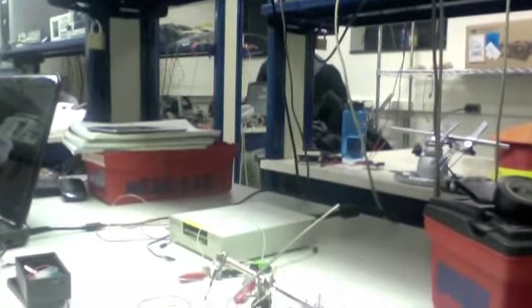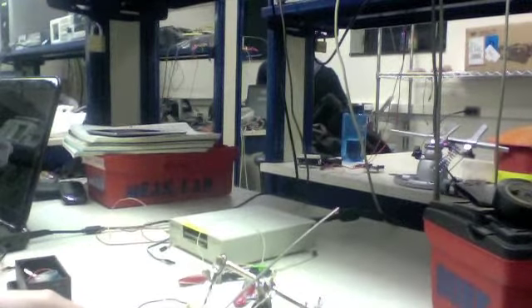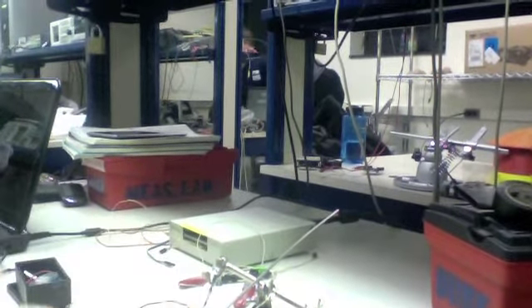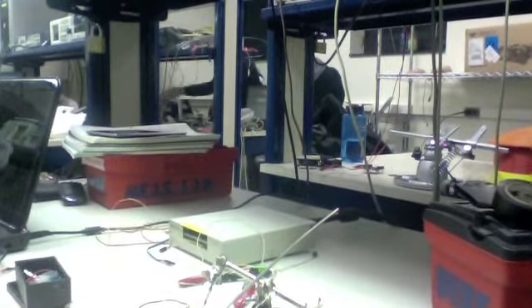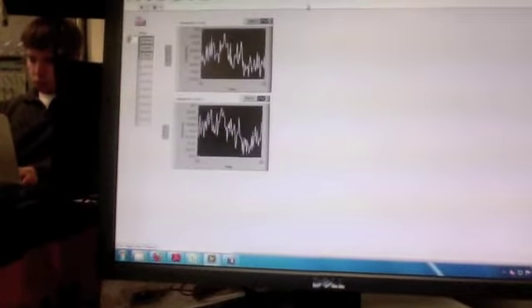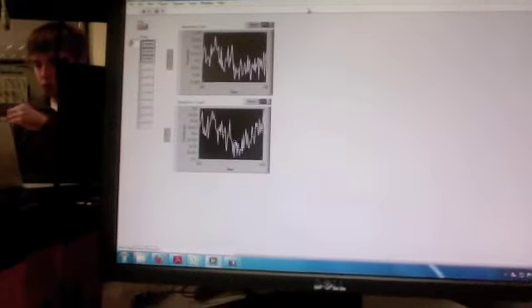So this is our Peltier device here, attached to a small PCB. The device is white here, which is also touching a heat pipe, which is this long rod here. And to look at some of the data, please direct your attention to the screen where we have a live feed of data because we have thermistors that are actively monitoring the temperature information obtained through the Peltier device.